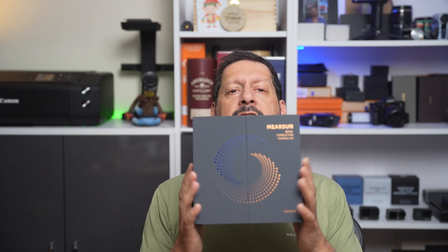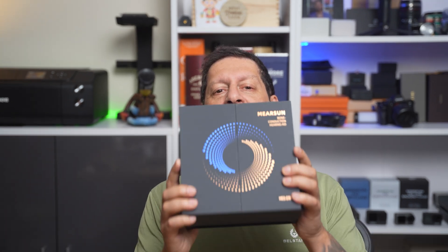Yes, these are the Mearsun bone conducting headphones. Before we get into it, Mearsun sent me these bone conducting earphones to review in exchange for my honest opinion — and you know that whatever I review, you're always going to get my honest opinion, good, bad, or indifferent. So let's get these out of the box and see what we have.